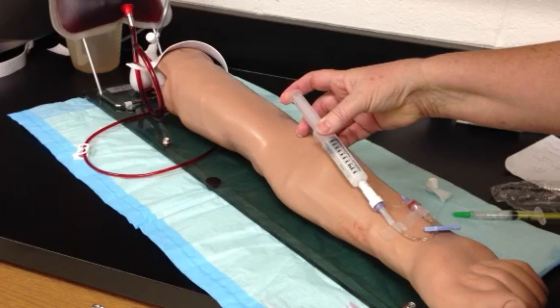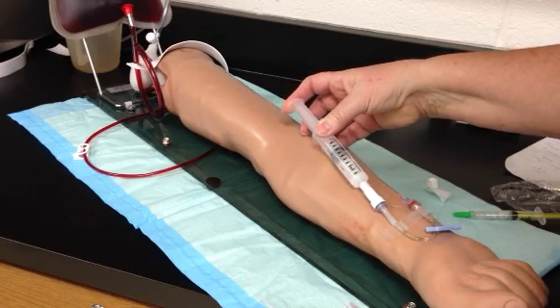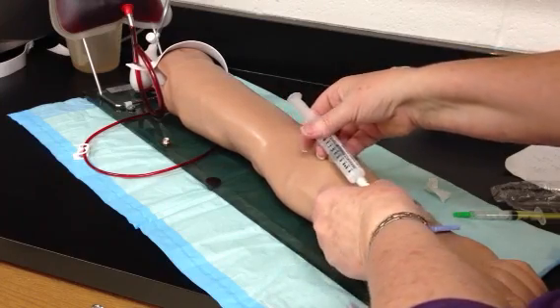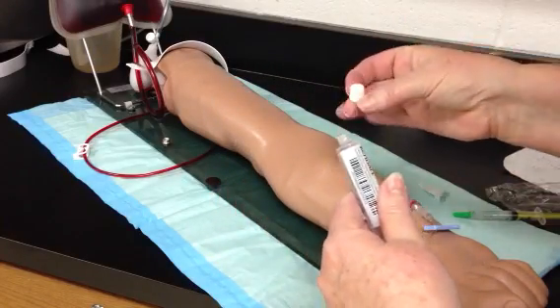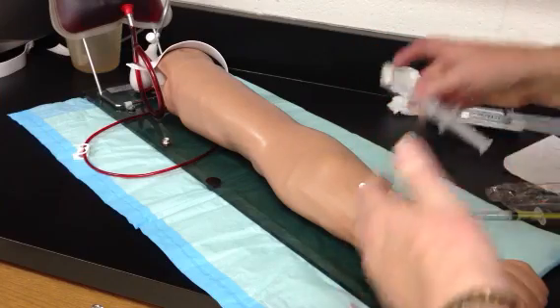And I will slowly push 3 milliliters of saline. I don't need to lock it off in between because I'm going to directly access that again in a minute. I'm going to replace my cap, and when I laid my cap down, I laid it with the tip up so I wouldn't contaminate it.